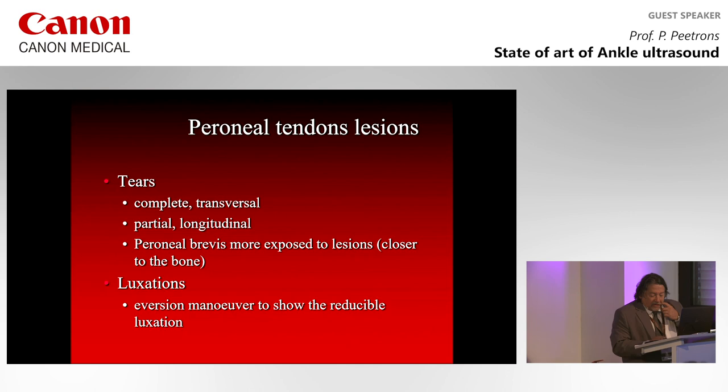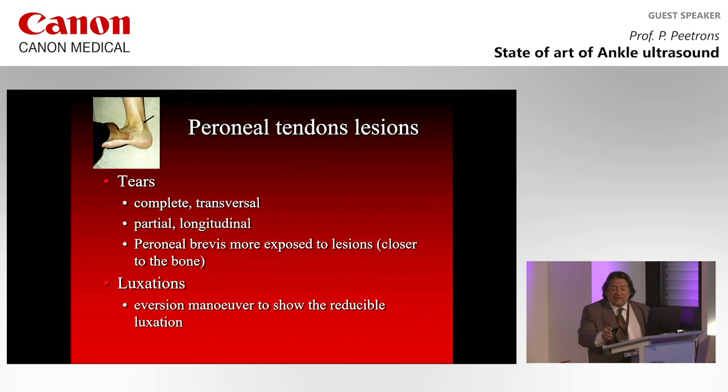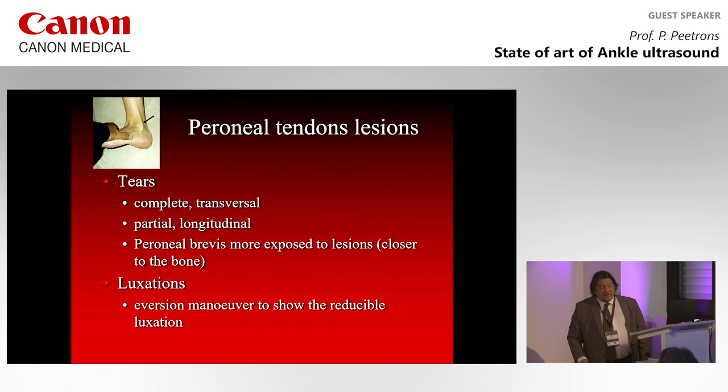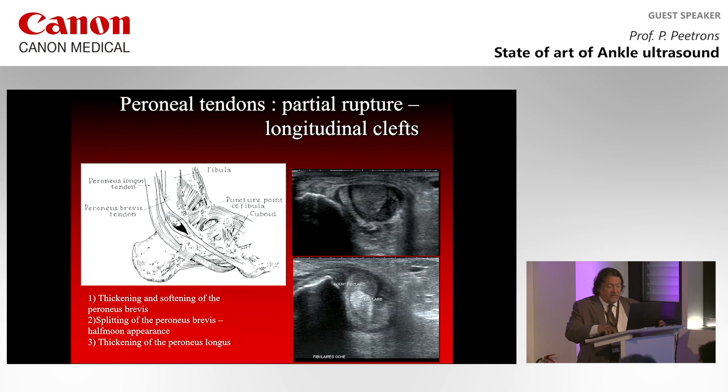So, this is the superficial peroneal nerve. Don't forget to look at the tendons also. Don't forget to test the tendons with an eversion maneuver. The eversion maneuver is this: you ask the patient to hyperflex dorsally, flexing the foot, and then to pronate the foot towards the lateral part, and you push a little bit with your thumb on the foot. This is the eversion maneuver to see reducible or irreducible luxations of the peroneal tendons.